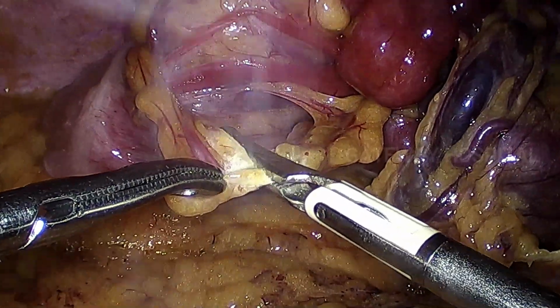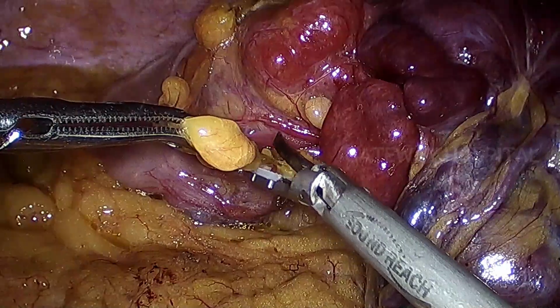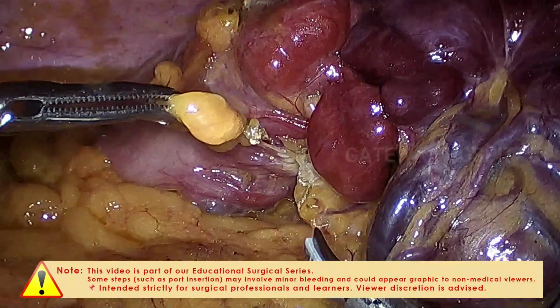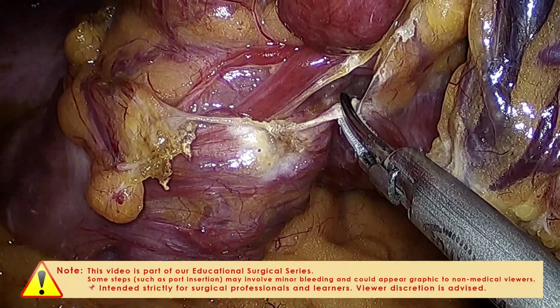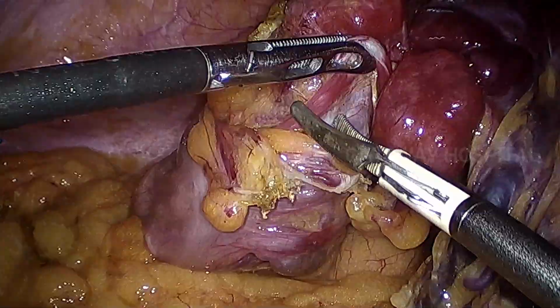And you can appreciate a pulsating vessel which is arising from the descending colon appendices epiploicae and supplying the tumor. There is a good gap, a very good gap between the descending colon and the tumor itself, at least more than a centimeter distance between the tumor and the serosa of the descending colon.